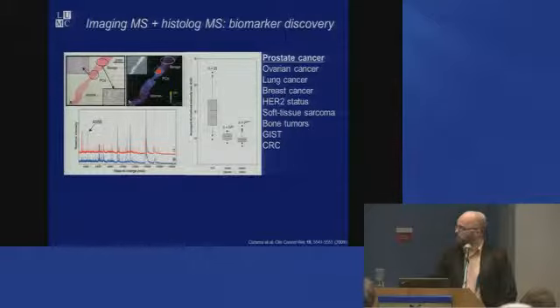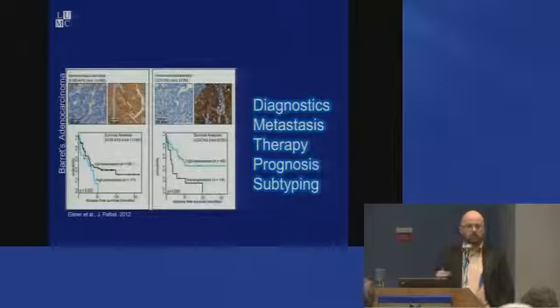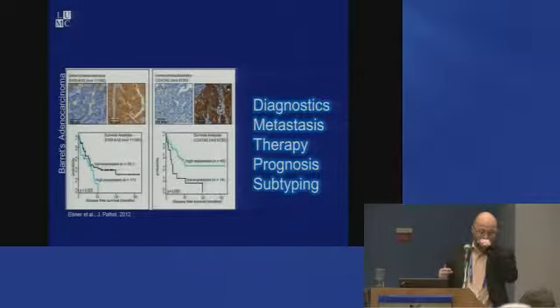And one of the areas where you can do this is to look for, say, prognostic markers that improve the differentiation or the diagnostic differentiation between various, say, diagnostically challenging tumors, response to therapy, subtyping. So in this case, this is Barrett's adenocarcinoma. It's an esophageal adenocarcinoma.